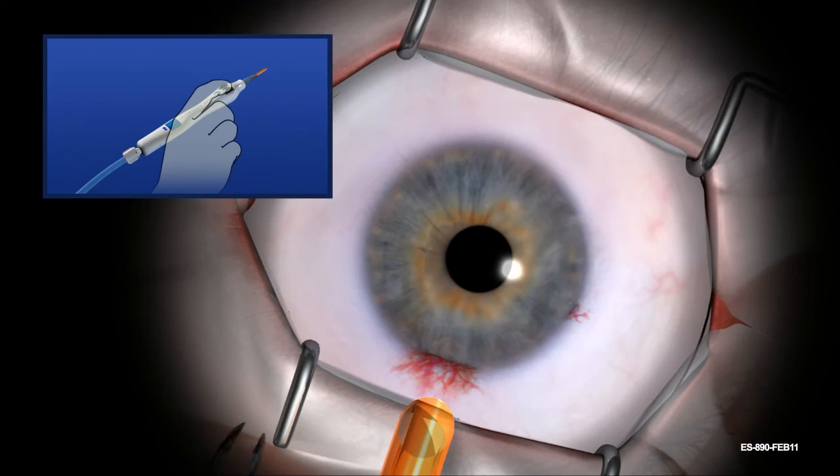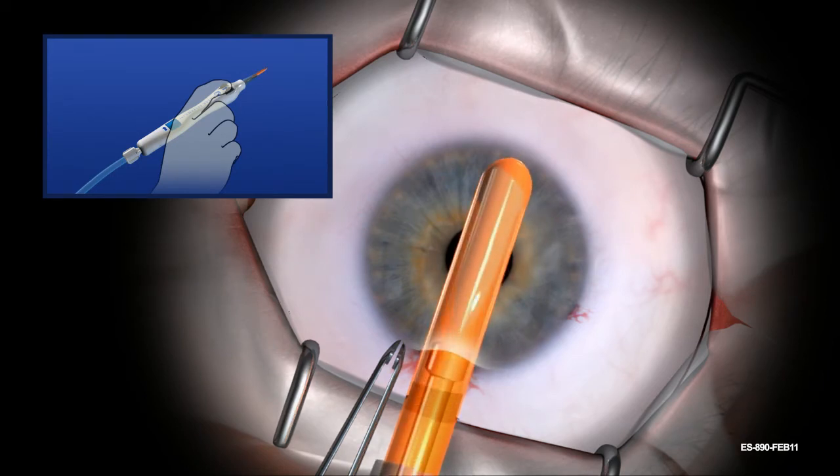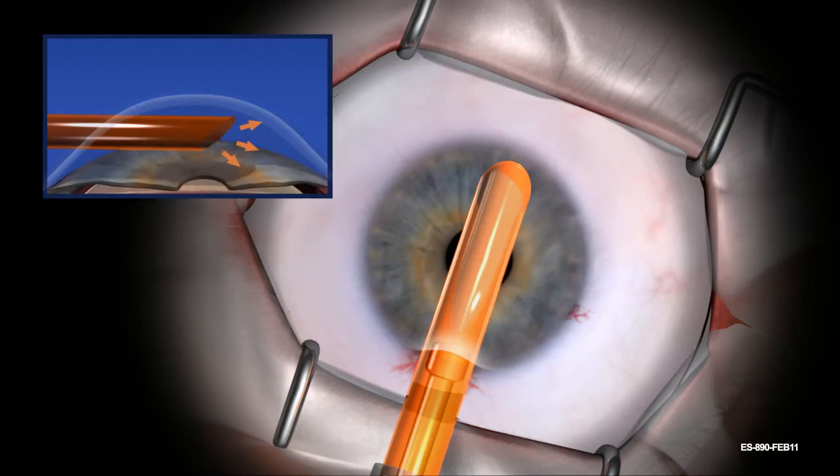Continue holding the black deployment wheels while inserting the beveled tip of the insertion sheath into at least the center of the anterior chamber. The deployment wheels must be held securely to avoid damage to donor tissue during insertion. The anterior chamber may be deepened using gentle irrigation through the device.